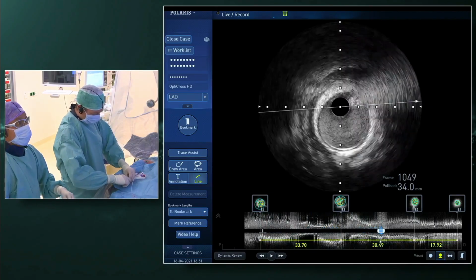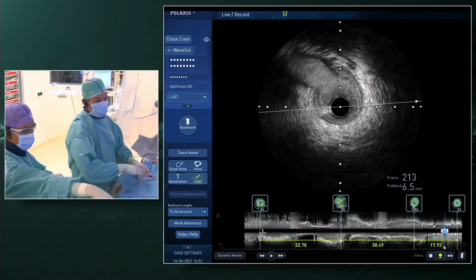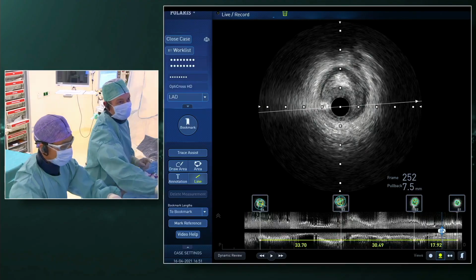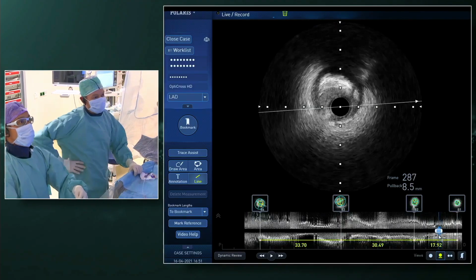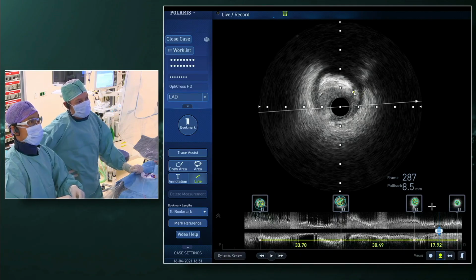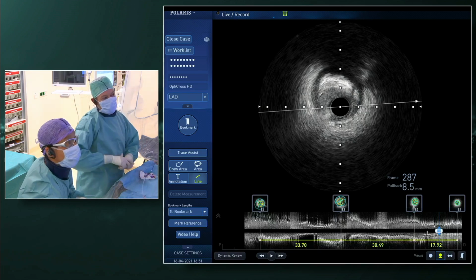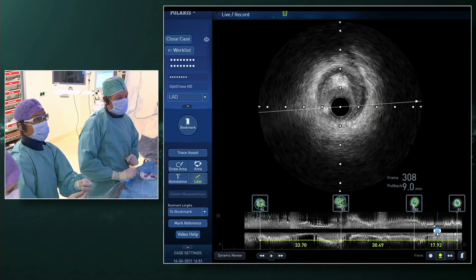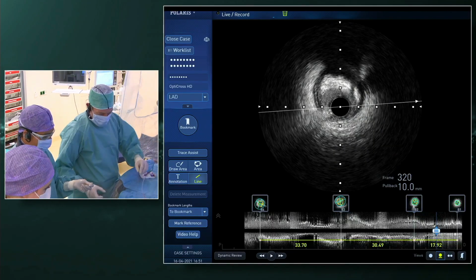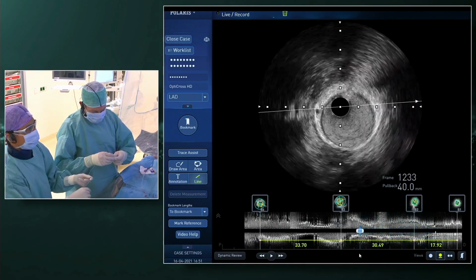Shall I take them through the result after orbital, what we saw on the IVUS? Yes, we'll show you, and this is pretty cool. You see the distal part of the IVUS here, where we did the orbital, where there was eccentric calcification. But even there, you can see a very nice crack that goes all the way through the media. It's a wonderful demonstration that this device worked with both eccentric and concentric calcium. Really nice demonstration. Thank you for showing that to us.